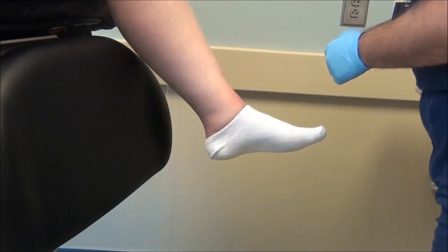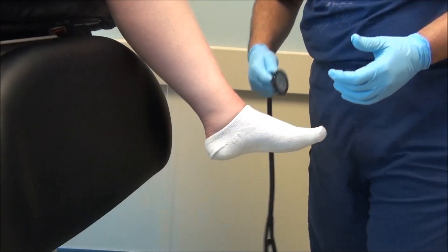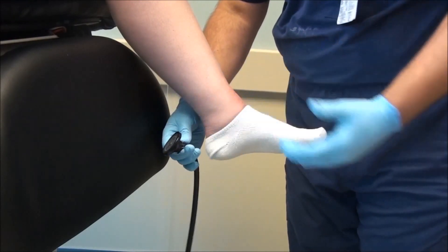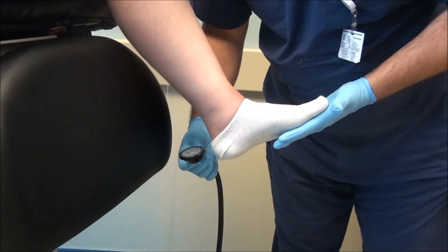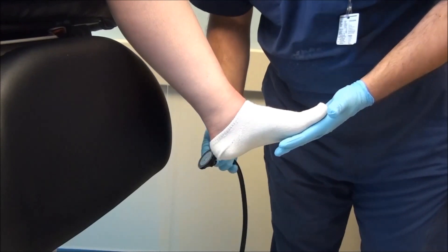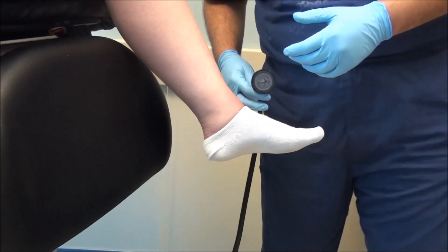An alternative — and this is probably the most common way that I test reflexes when I'm on the floors in the hospital — is to use my stethoscope. It has a nice flat edge and is a very simple and easy tool to use. Again, holding the foot in a neutral position and then tapping with your stethoscope to get an ankle reflex. Yet another simple test for loss of protective sensation.